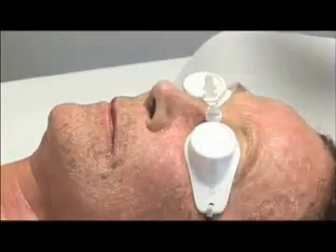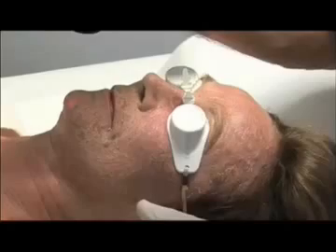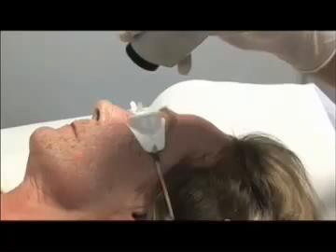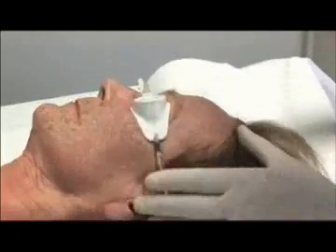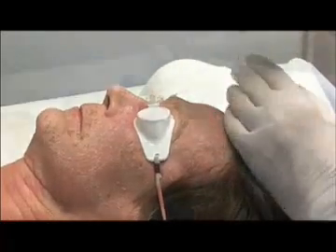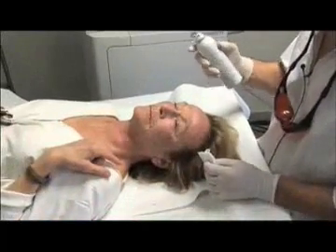From now on, I'm going to sweep over smooth areas such as the rounded edge of the chin. This is a superficial sweep. The nose. We're going to spray with thermal water.